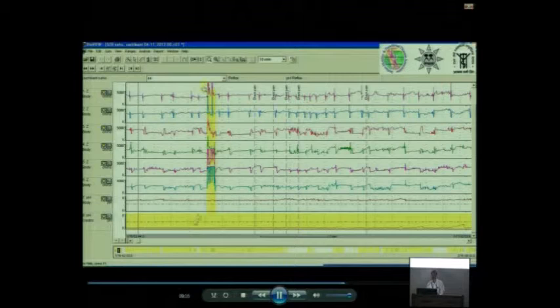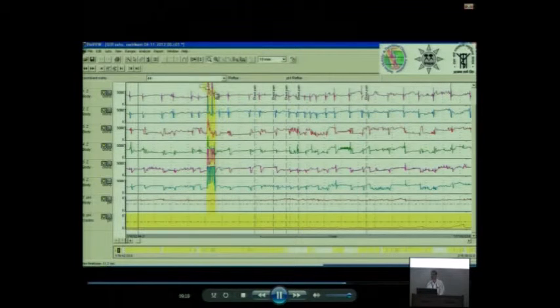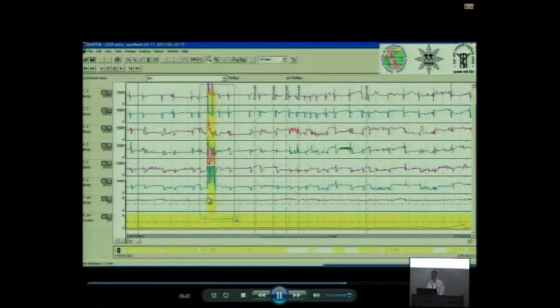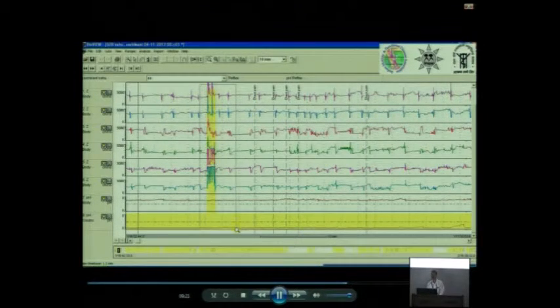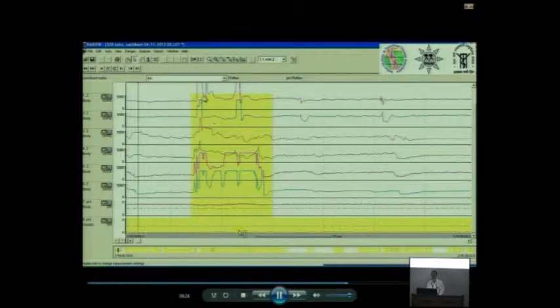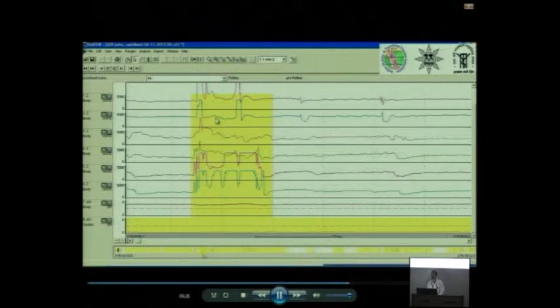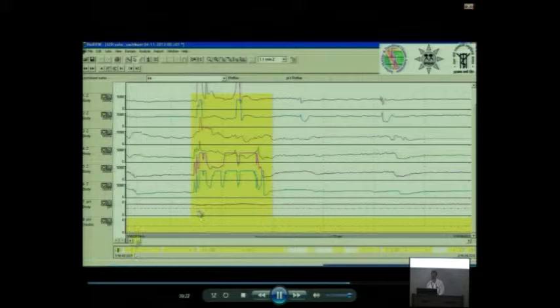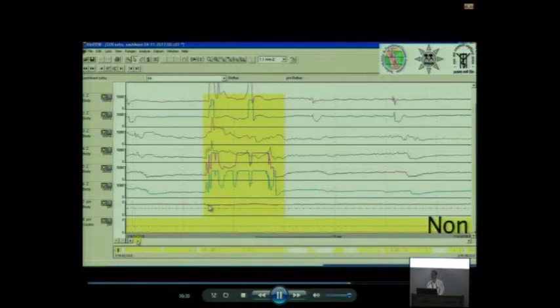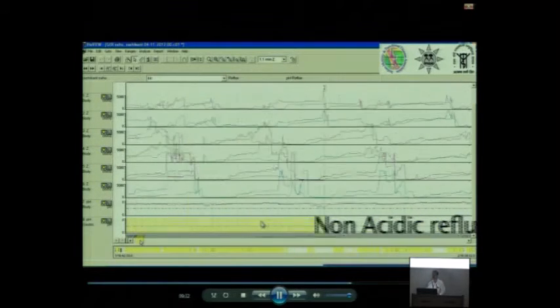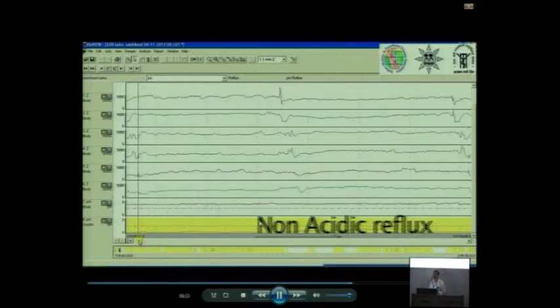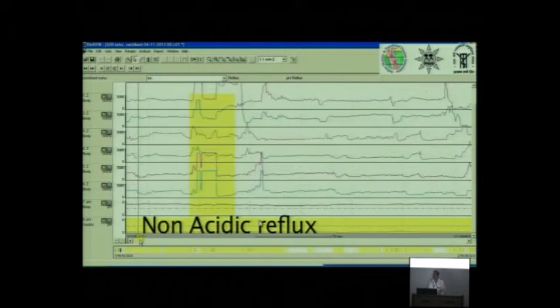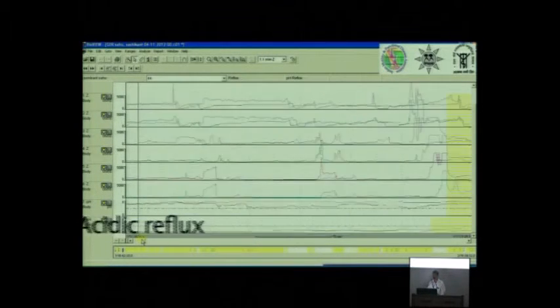Look at this, already the system has given a yellow mark over here, and the system says there is an abnormality here. We know what is the abnormality. This is gas. Look at that, impedance value has gone up, and look at the pH value. pH has not dropped below 4. So here is a gas reflux where pH has not gone below 4, but the impedance has gone high.